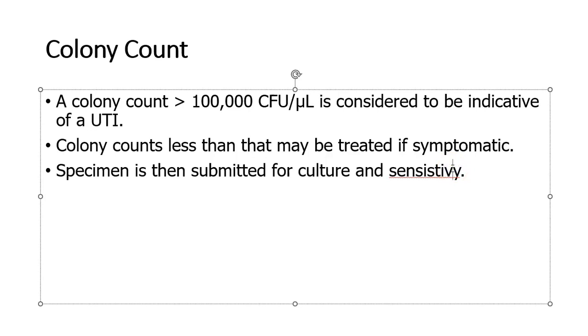But what we're going to do is treat it if they're symptomatic. The doc may say, go ahead with the colony count, I don't care what it is, do it. And we would do it. Okay. And that's just what we do. So I just wanted to take you through this to show you this is what's usually done in the lab behind the scenes with one of the cultures that we may do.